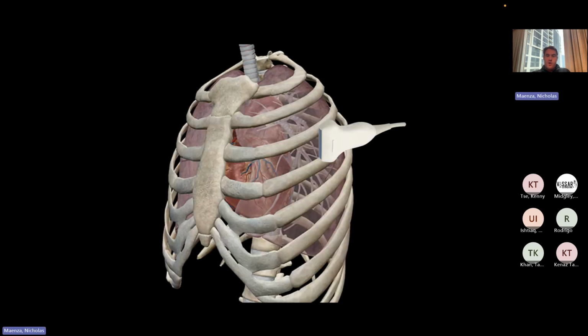All right. The reason I was harping so much before on the importance of talking about the rib cage being above the ribs, the rib cage being above the lung, is that you need the ribs to orient yourself when looking at thoracic ultrasounds. When you're looking at a thoracic ultrasound, you need to see that visceral and parietal pleura. And if you don't see ribs to orient yourself, it can be very confusing.